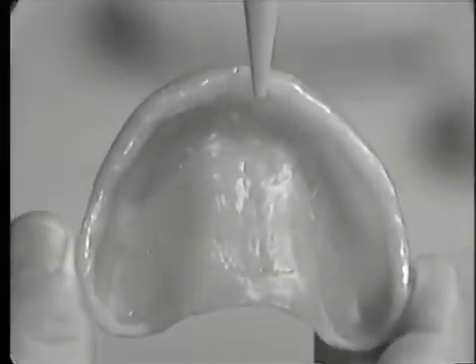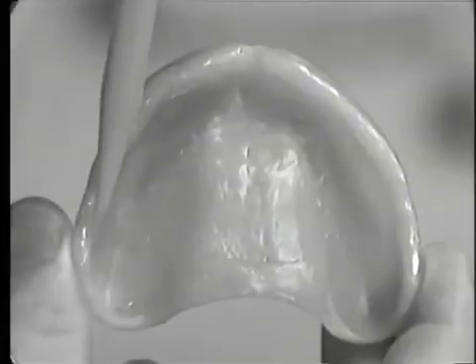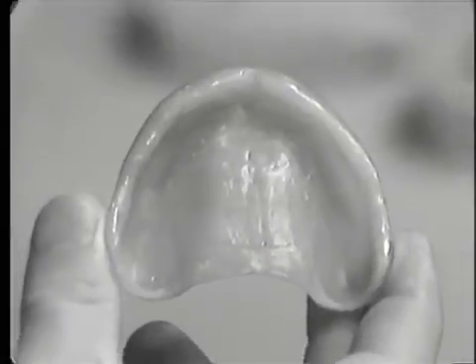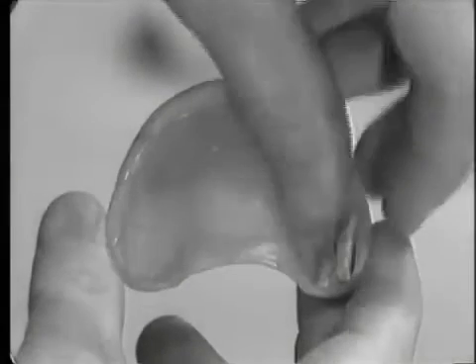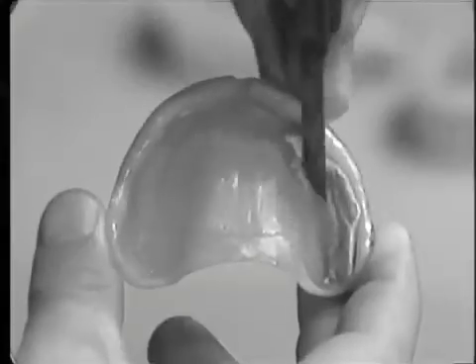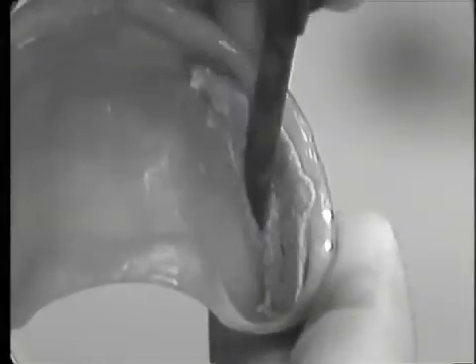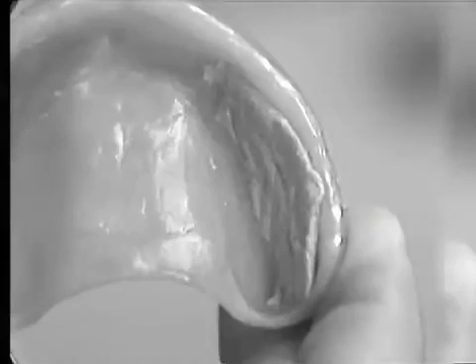This denture and the residual ridge illustrates both anterior and posterior undercuts. Blockout media will be needed in both of these areas. The asbestos is wet, rolled up, and placed into the undercut area. It is gently tapped into place with either a number 7 wax spatula or a laboratory knife. Care should be taken not to have the blockout media onto the tissue surface of the denture in areas which are not involved in the undercut.